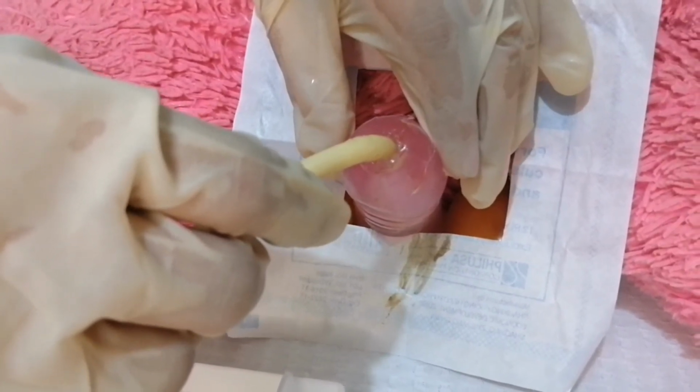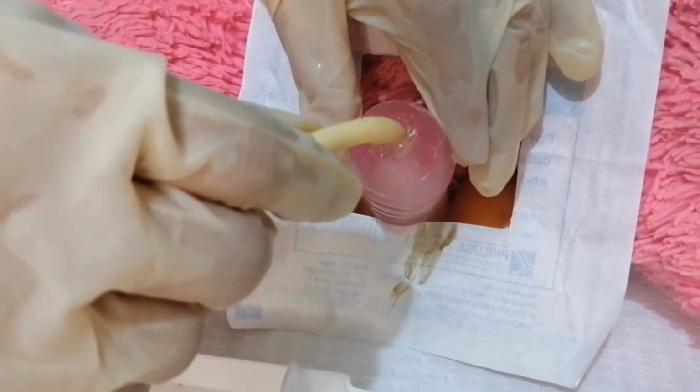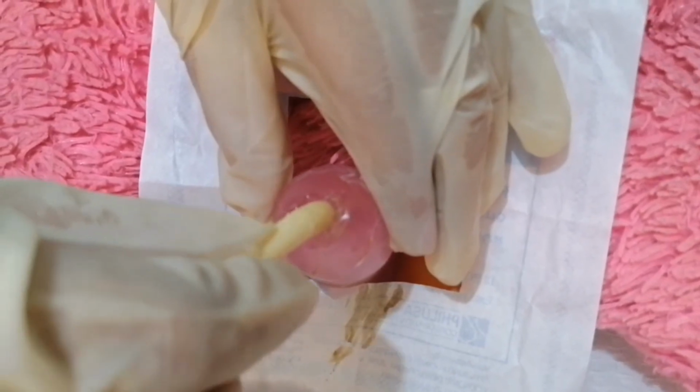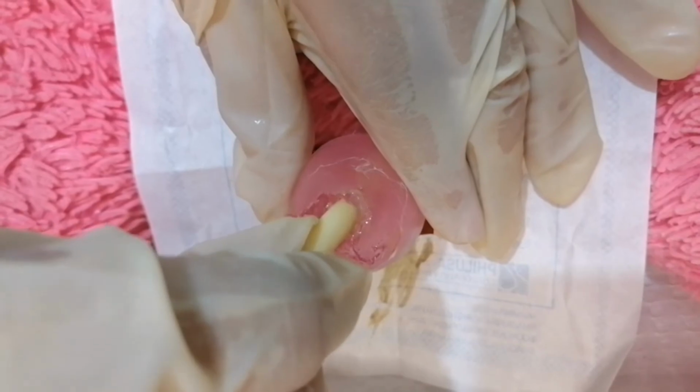Ask the client to breathe deeply and rotate the catheter gently if slight resistance is met. Excuse me, sir. Take a deep breath. The next procedure is to hold the catheter securely with your non-dominant hand while the bladder empties. Collect a specimen of about 20 to 30 ml if required. Continue drainage according to hospital policy.